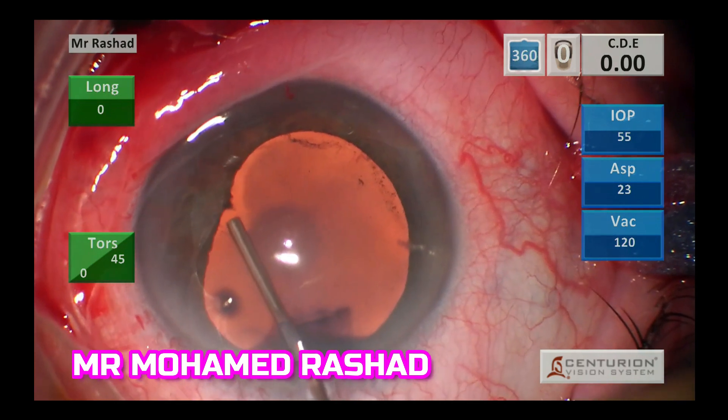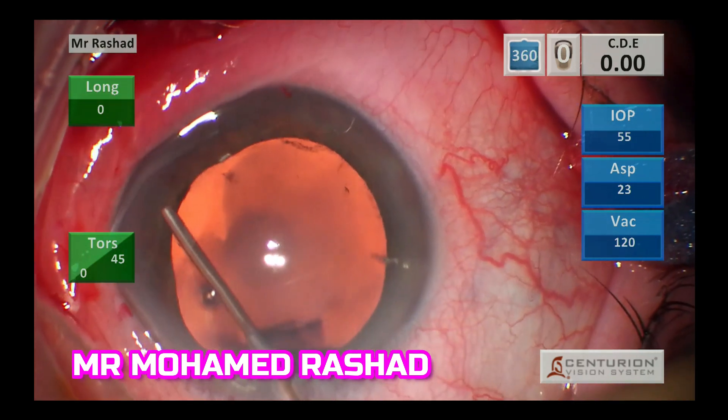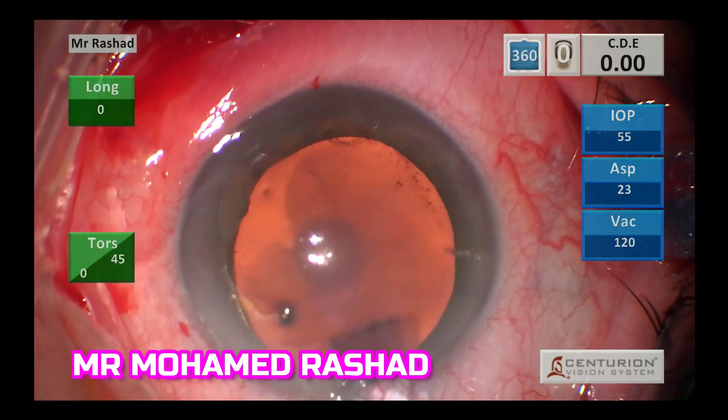So now the adhesion is free from the anterior capsule, then I will inject OVD, changing the heart-shaped pupil into a rounded pupil.